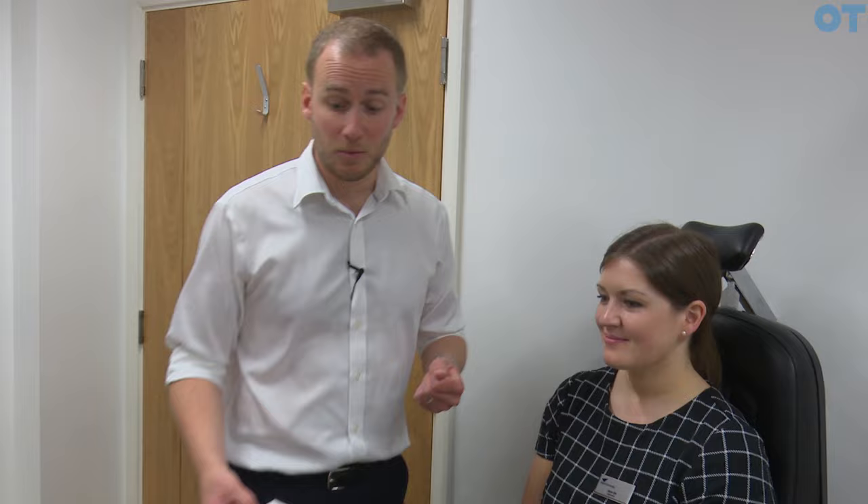In order to instil a drop we give the patient a tissue. Because this is a topical anaesthetic we need to encourage them not to rub their eyes — the drug takes a few seconds to remove corneal sensation so the patient can dab their eye but should not rub. We ask the patient to tip their head back, look up to the ceiling, and we're going to place a drop into both lower fornices.